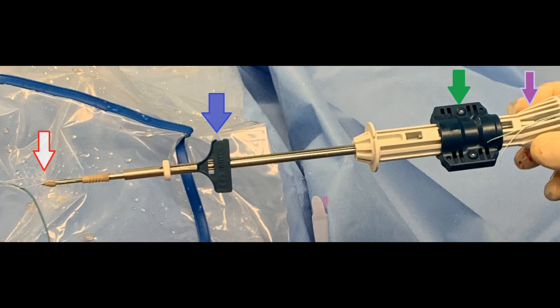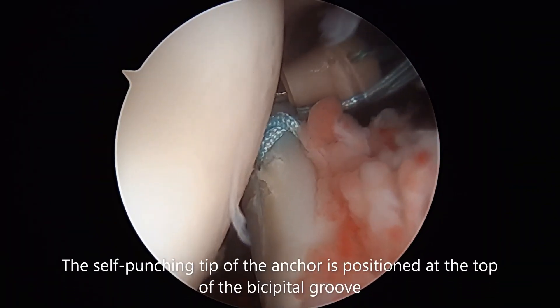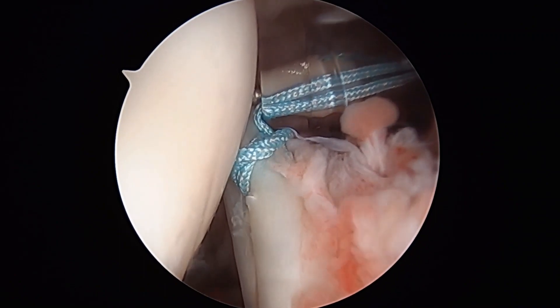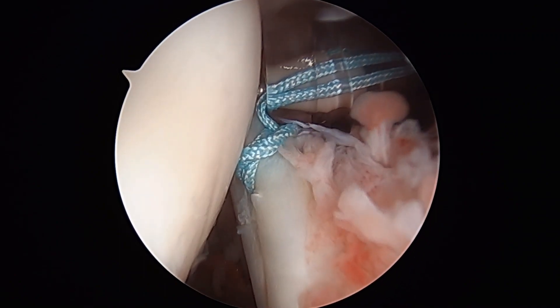When the anchor is ready to be deployed, we hold the blue paddle, as seen by the green arrow, and the wheel is turned, as noted by the purple arrow. When it is ready to deploy, the tip of the anchor is placed at the top of the bicipital groove.